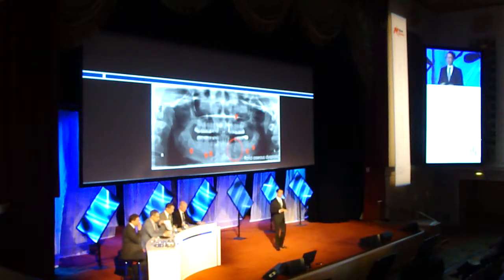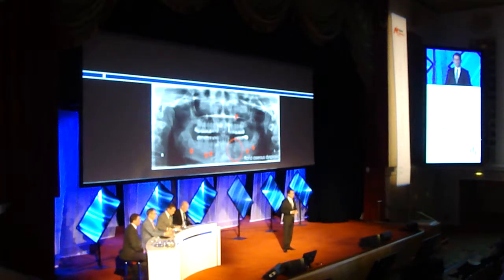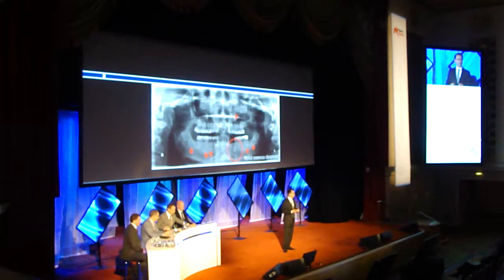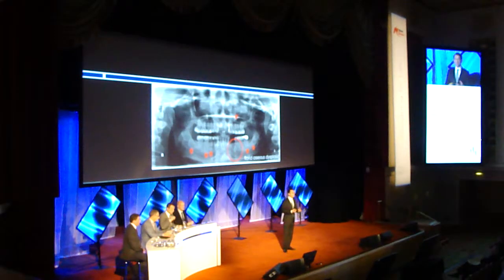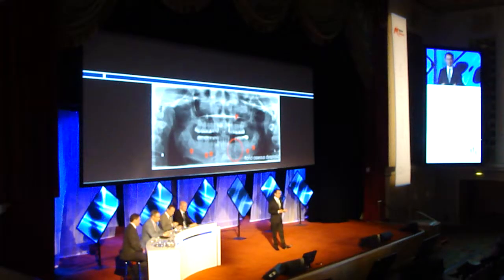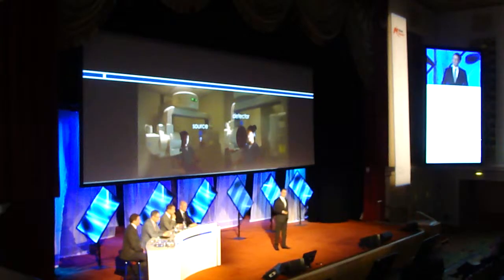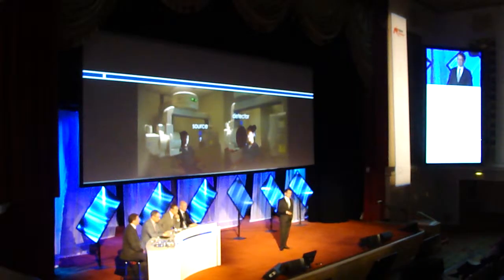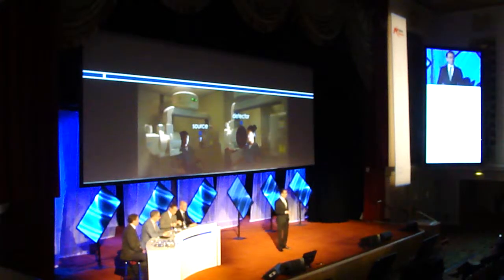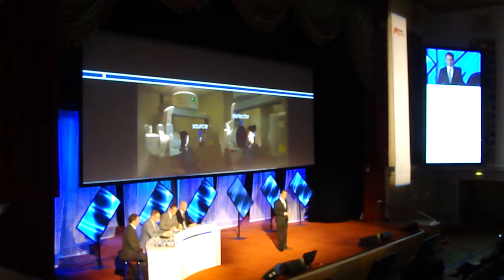It's well known that in the most mature form of this disease, of this dysplasia, the vascular supply in these areas is actually very, very limited and restricted. And this can have a negative impact on the patient if a dental implant is placed here. So nowadays, what we typically do when we see patients being treatment planned for dental implants is we protocol cone beam CT or medical CT scans.